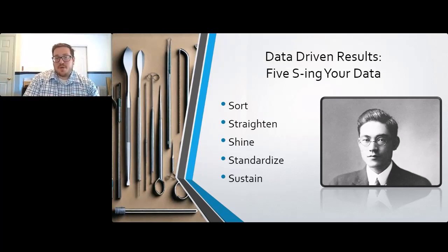When you think about what sterility of 10 to the negative 6 means, it's a 6 log reduction. So 1 in a million that something went wrong and that a pathogen survived. That's a razor thin margin. So lean has had a lot of impact in SPD because they have mirroring prerogatives and a very similar margin of error. So we're going to go into these and how they apply to your data.